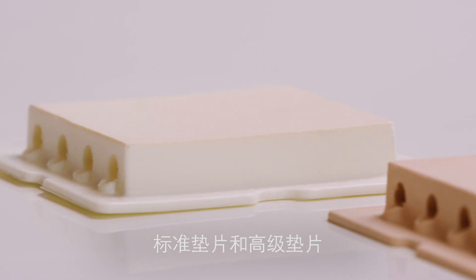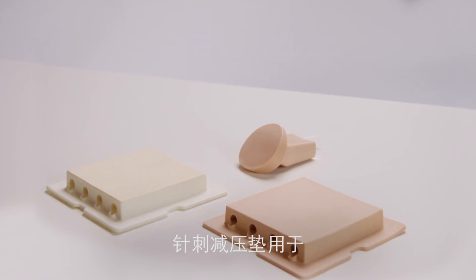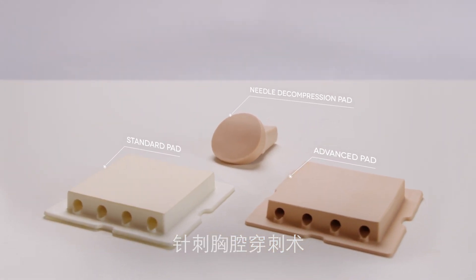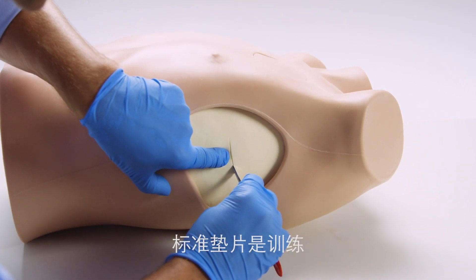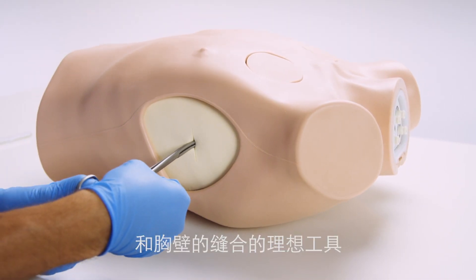The trainer can be used with the standard or advanced pads for chest tube insertion and chest drain. The needle decompression pads can be used to convert a tension pneumothorax into a simple pneumothorax. The standard pad is ideal for practicing blunt dissection chest tube insertion and suture of the tube to the chest wall.